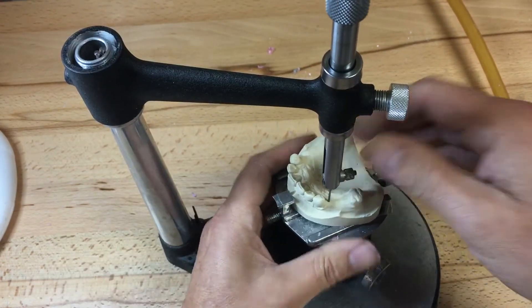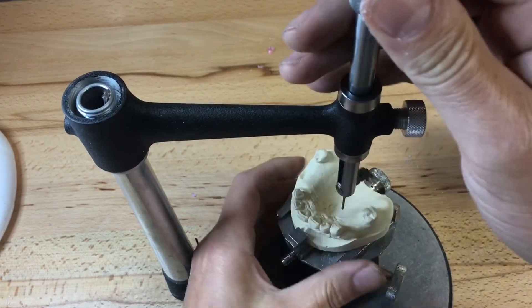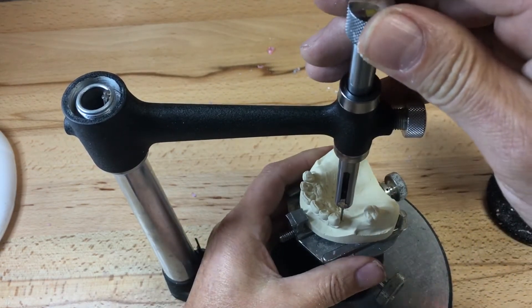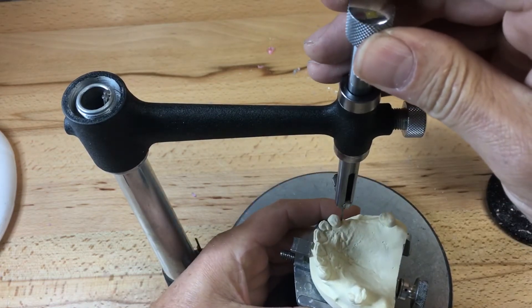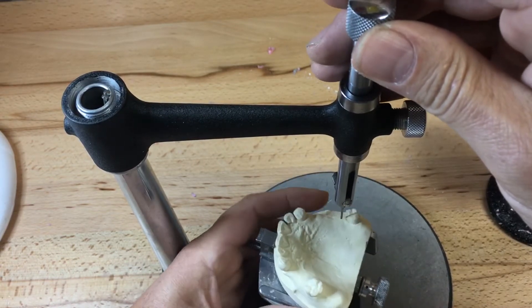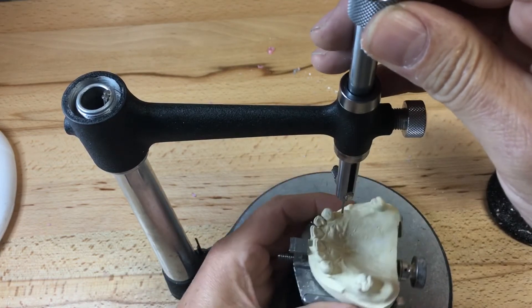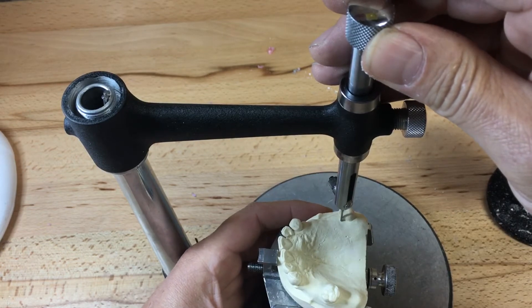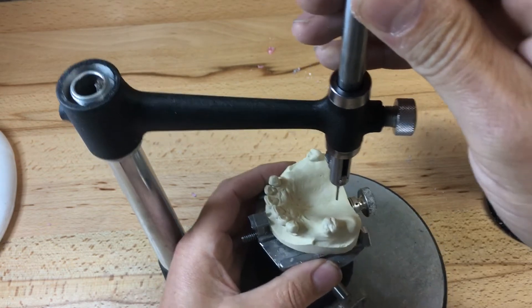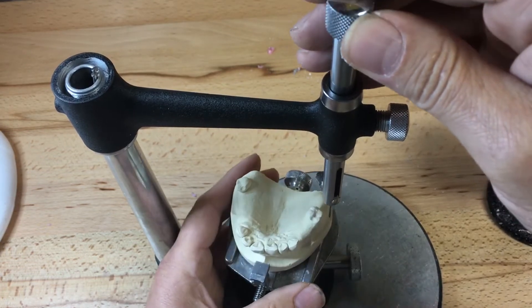They'll maintain some elasticity if we bend them and laser weld them post construction of the casting. The first thing we should do is start at the set-zero position here for our path of insertion. I'm going to identify the guide planes distal of 1-3, mesial of 1-6, distal of 2-3, mesial of 2-7, and try to equalize these guide plane undercuts if any exist. On the 2-7 there's a slight undercut.